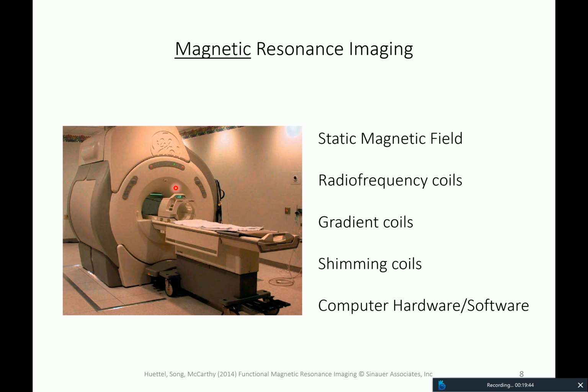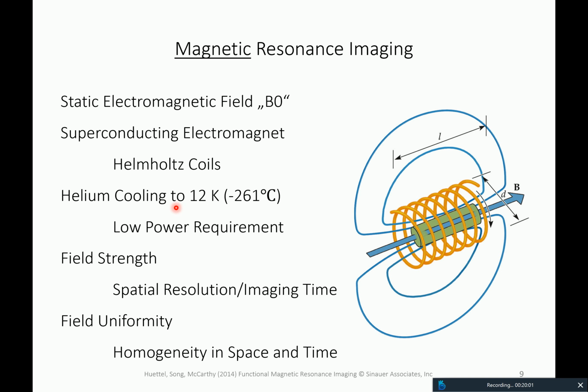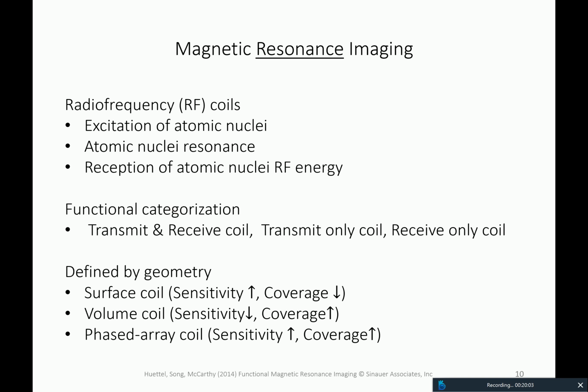So the setup used the radio frequency pulse and excitation from the body coil, and for better imaging properties of the brain that we are interested in, there's then a pure reception head coil. So they come in different functional types, and they come in different geometric types.